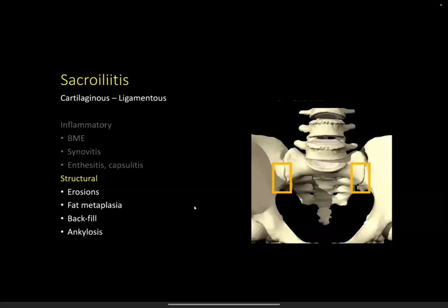So the next question is, why is fatty metaplasia bright on STIR images? Because this is not normal, fat gets suppressed. I think I'll read up more and maybe answer later. I'm not sure about the exact physiology. Probably the intracellular, extracellular fat concept comes into the picture, if I'm not wrong. Okay, I'm not sure that it should be bright.